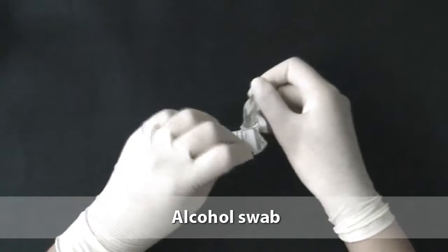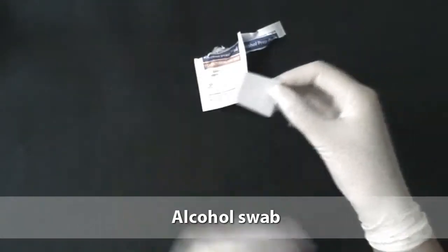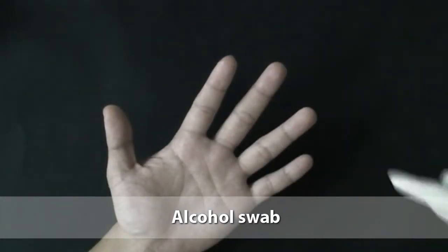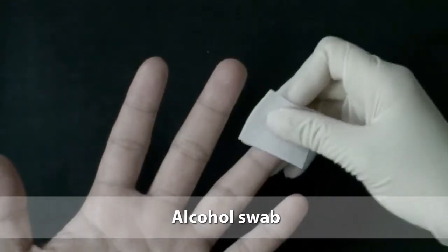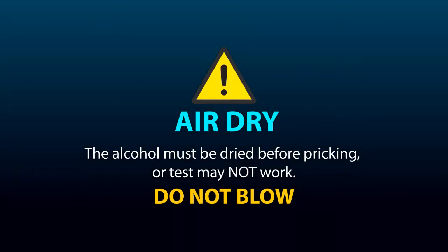Open the alcohol swab. Grasp the 4th finger of the test patient's hand. Clean the patient's finger with the alcohol swab thoroughly. After cleaning the finger, it must be allowed to air dry. Remember, the alcohol must be dried before pricking, or the test may not work.